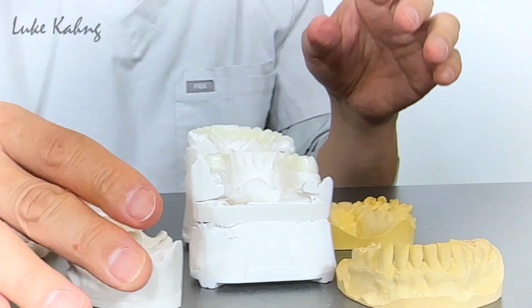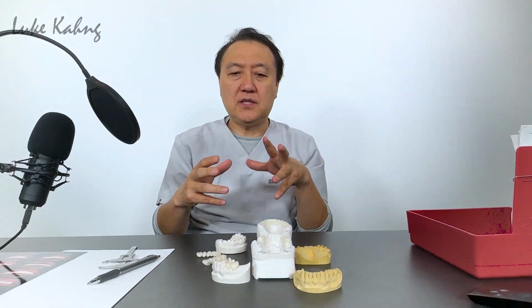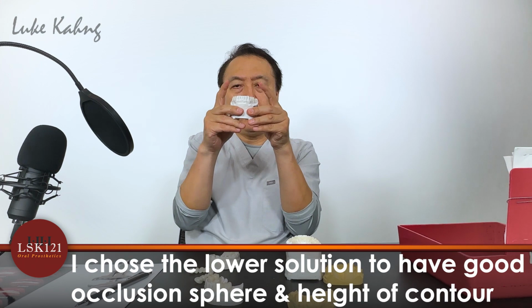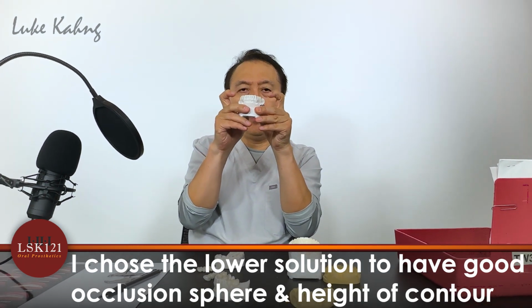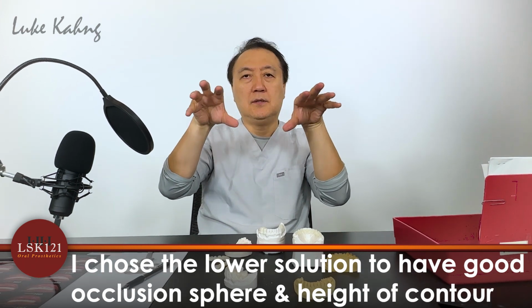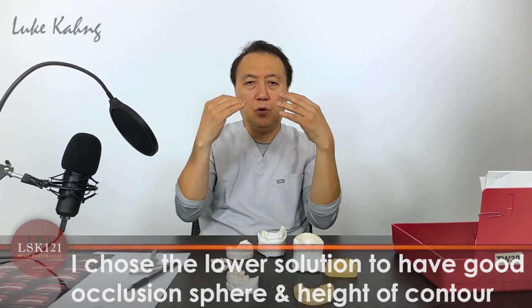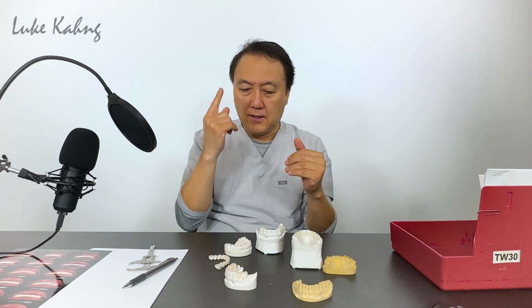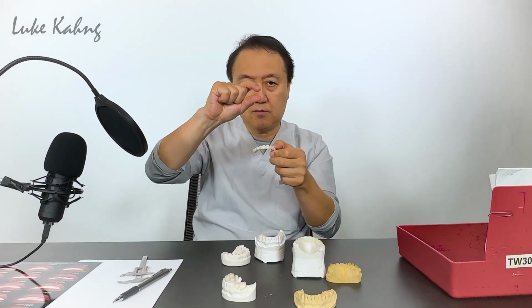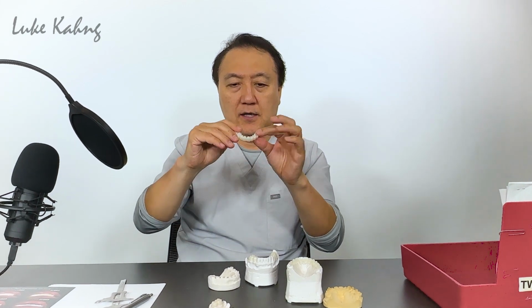So once I set up the teeth, the reason we set up the lower teeth first is that, compared to the canine, the premolar and molar have to make good occlusion, the curve of Spee and Wilson, and the height of contour. So the lower is set first, and then after we increase the vertical dimension, we set up the teeth longer, higher, all the way to the top.